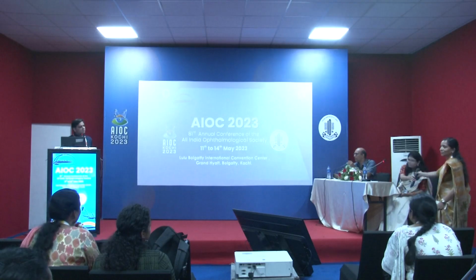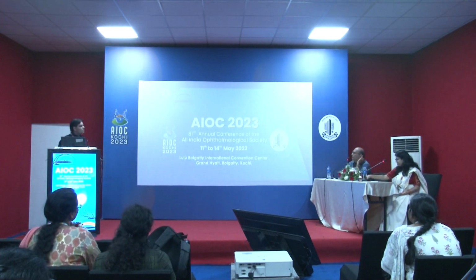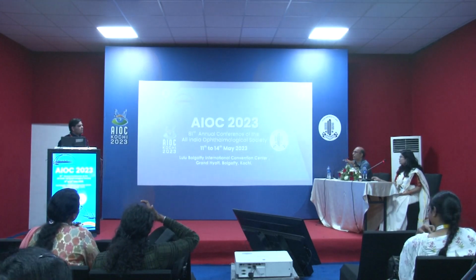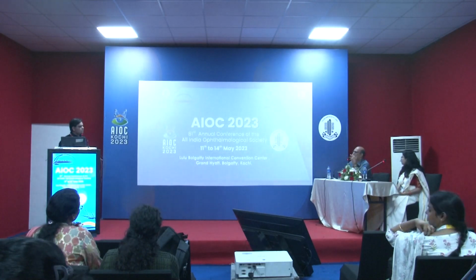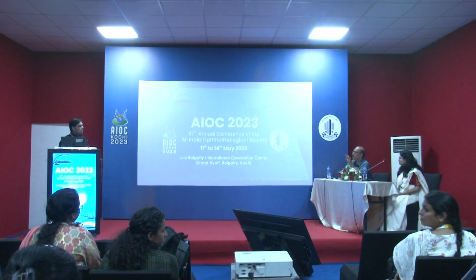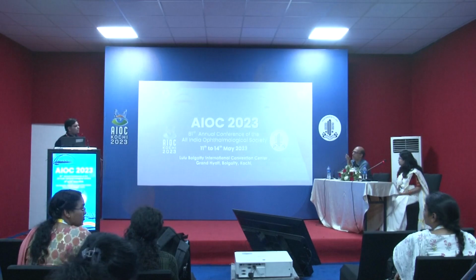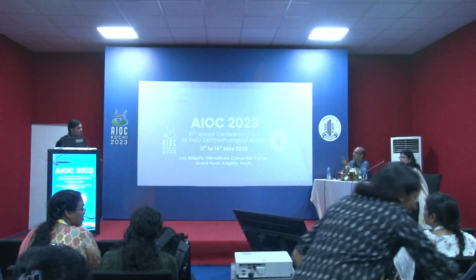Thank you, sir. One more question, we had a little bit of confusion. When mucormycosis was so popular, we thought that ENT people are the first to do FESS, and still there are a lot of controversies regarding the diagnostic and clinical appearance of mucormycosis. Can you highlight which is the earliest sign of mucormycosis to be detected by MRI?